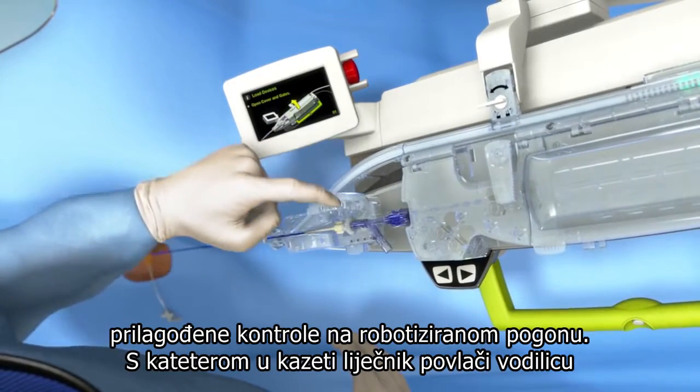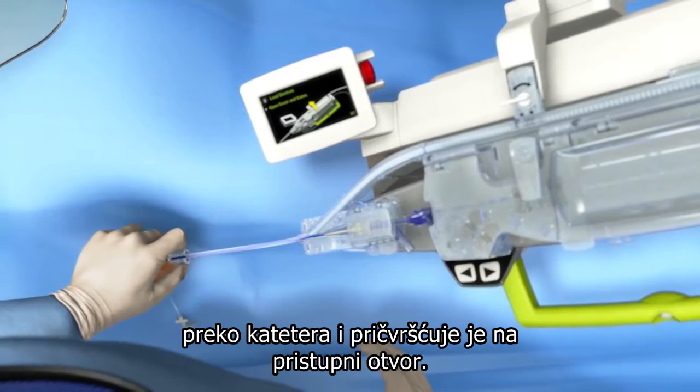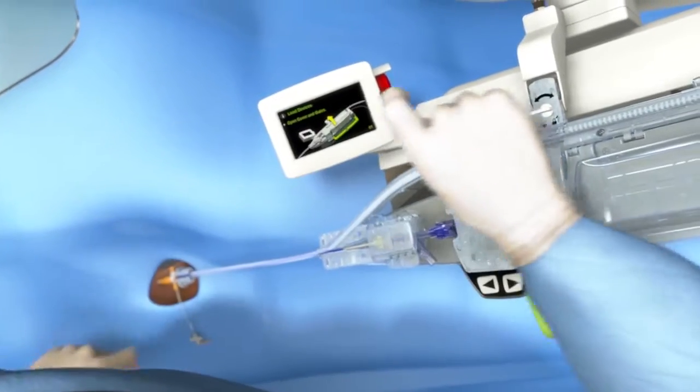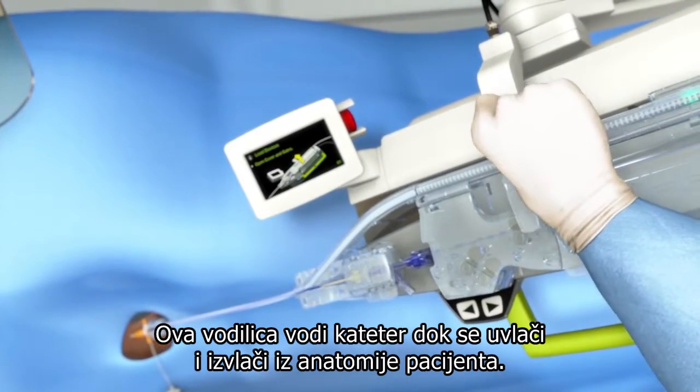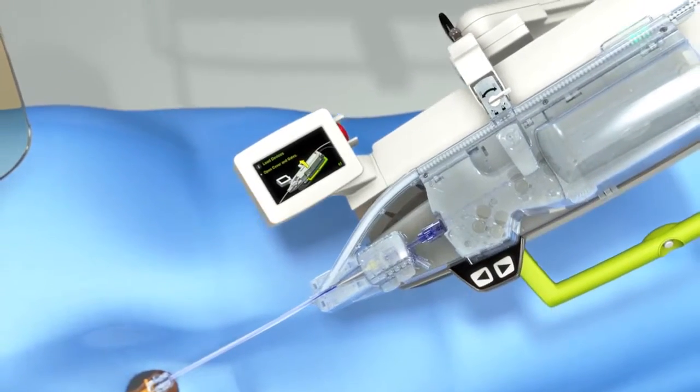With the guide catheter securely in place within the cassette, the physician pulls the guide support track over the guide catheter, securely attaching it to the introducer sheath. This guide support track supports the guide catheter as it is being advanced and retracted within the patient's anatomy.